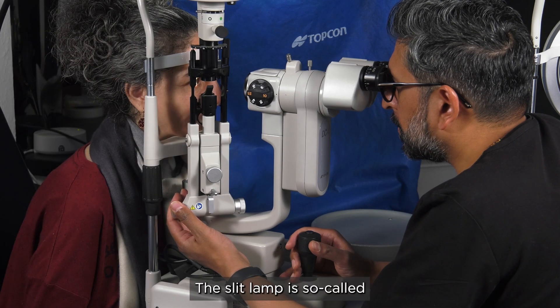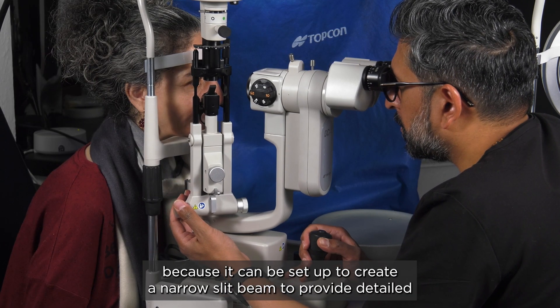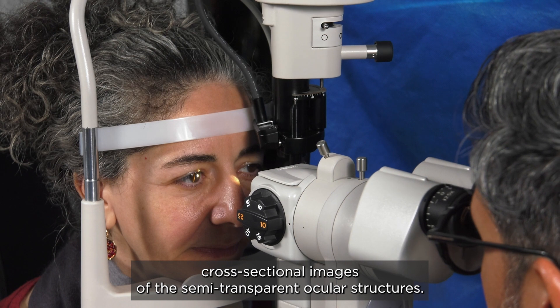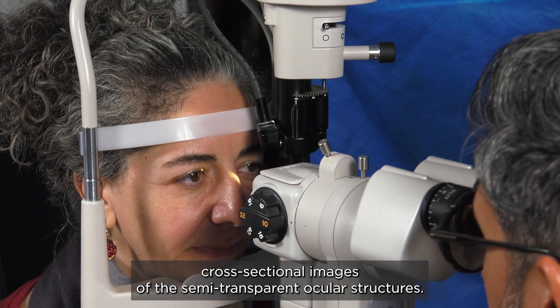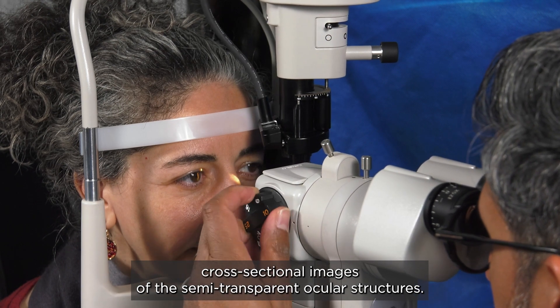The slit lamp is so-called because it can be set up to create a narrow slit beam to provide detailed cross-sectional images of the semi-transparent ocular structures.